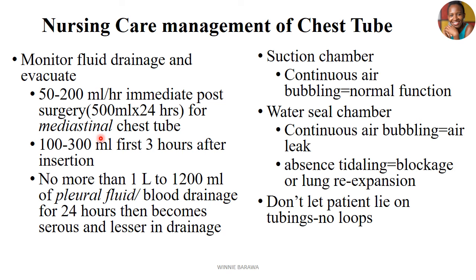The other bit is learning how to monitor the suction chambers. In the suction chamber, if you have continuous bubbling, then it means that there's normal function.